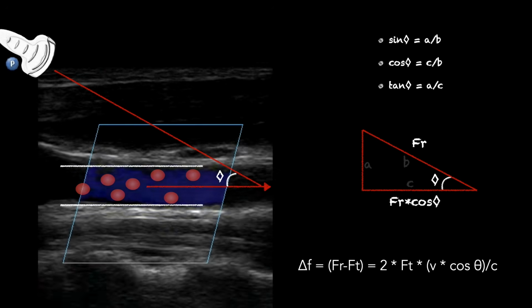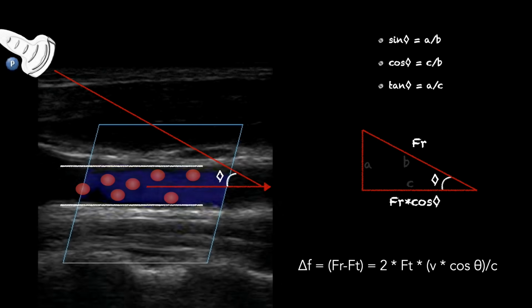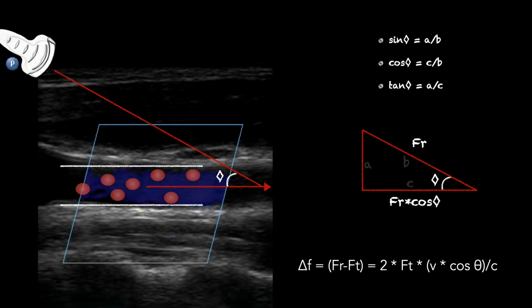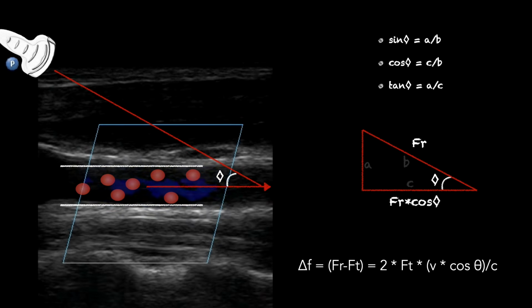Which brings us to really the important point. And a lot of this is math. Probably a lot of you guys are glazing over this and being like, why are we talking about math in an ultrasound lecture? Well, number one, I'm a nerd and I like this, so sorry, you're going to have to enjoy it with me.